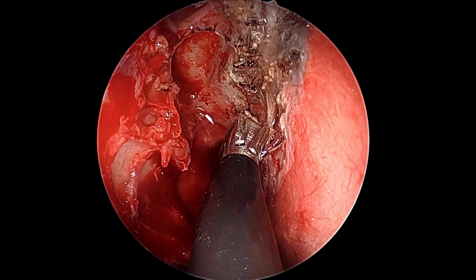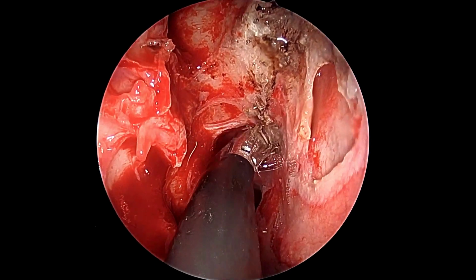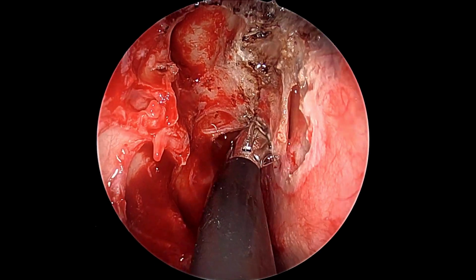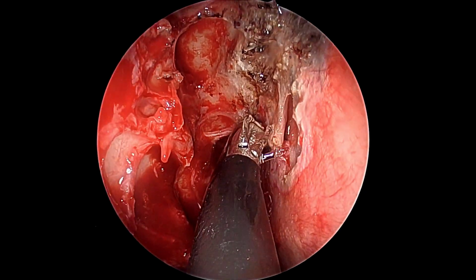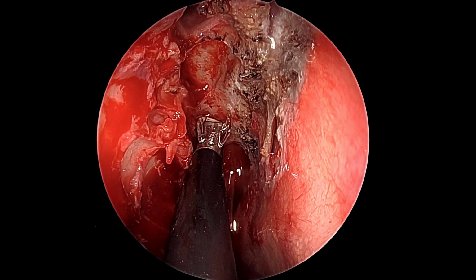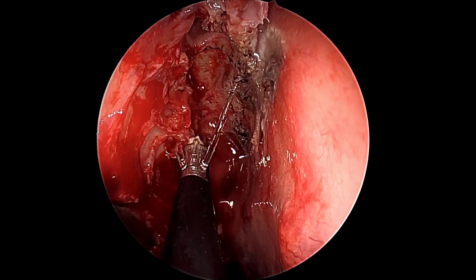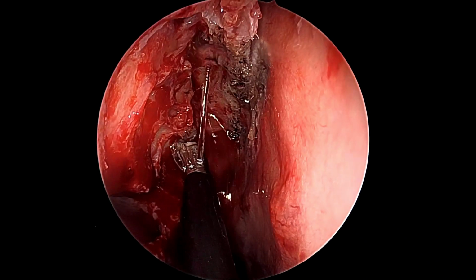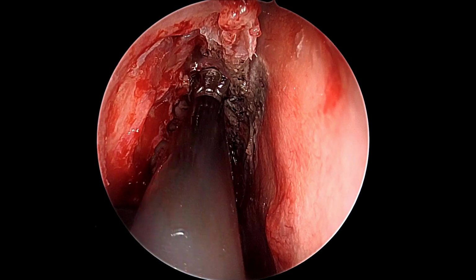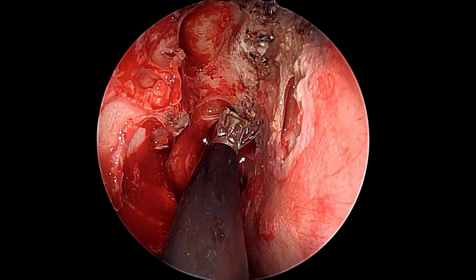So once most of the flattening of the bone has been done, we take one final attempt at devitalizing the mucosa around the defect, going as far posteriorly as the posterior septum, to create a good implant bed. The better these steps are performed, the better is the uptake of the graft on this bone. So we can see here that this step has been accomplished nicely.